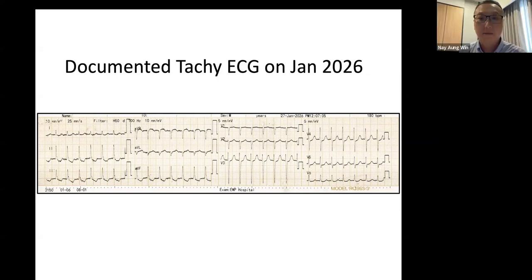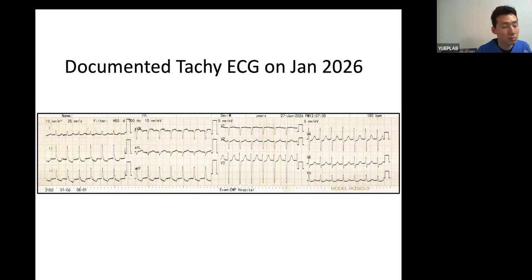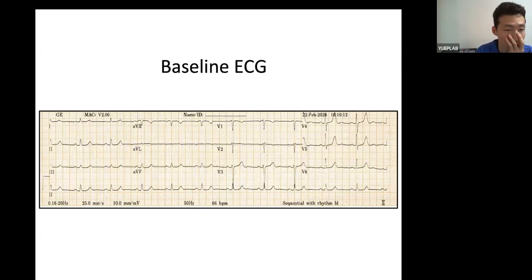Okay. So let's go on, and then your 12-lead ECG shows what? Which is the maximum deepest? Now go back there, tachycardia. What's unusual about this ECG? What do you see? Transition is not normal, right? Late. Before V5, the R wave, right? Okay. Go next. Sinus rhythm ECG.